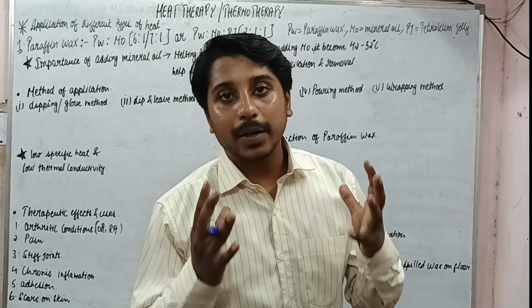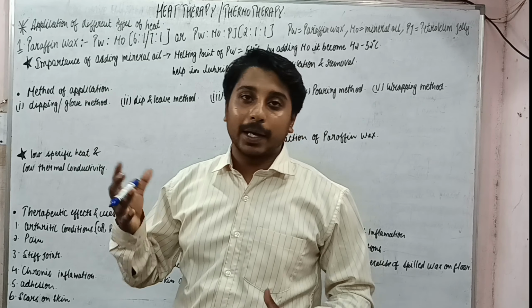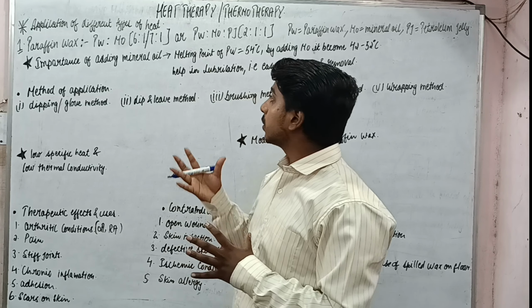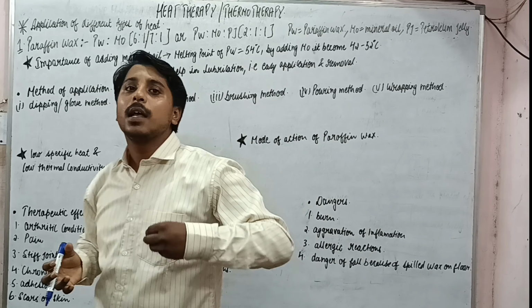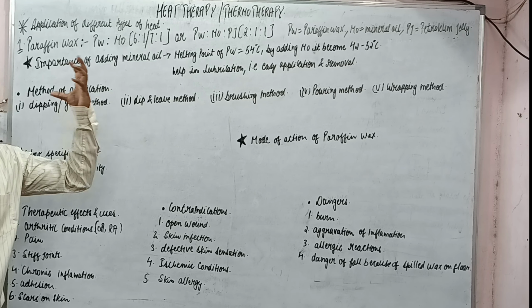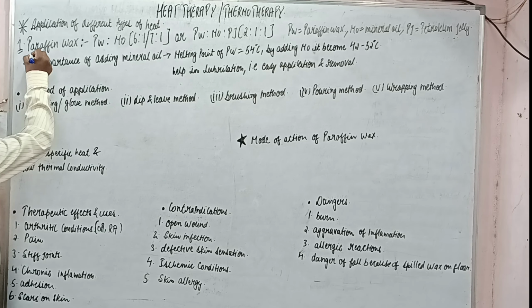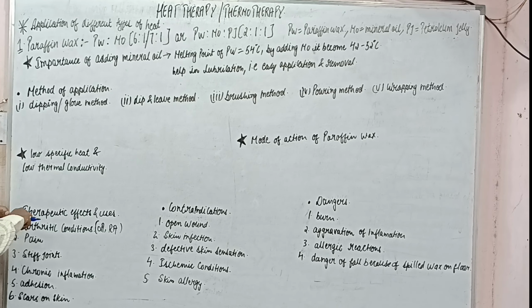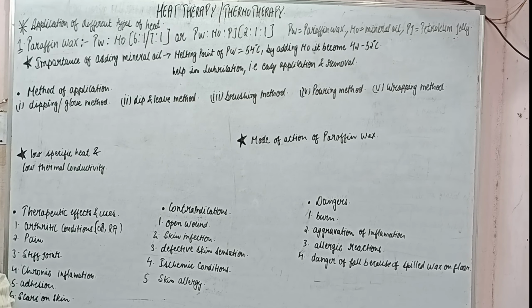We are back with our next lecture on heat therapy or thermotherapy. Now we are going to study the application of different types of heat, that is, various types of heat which are used to produce the heating effect. First is the paraffin wax bath.